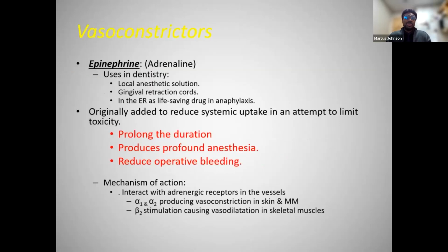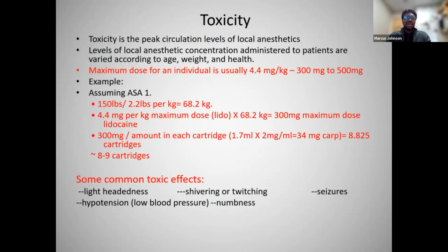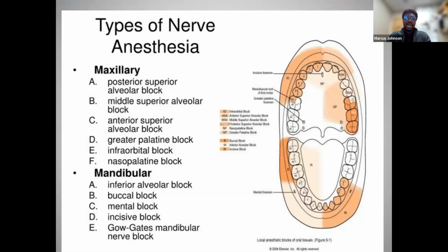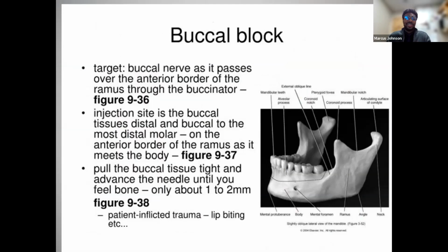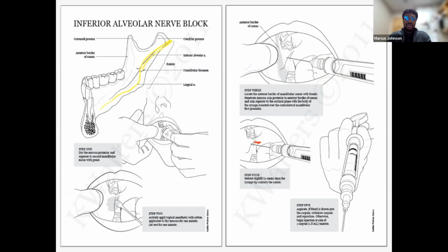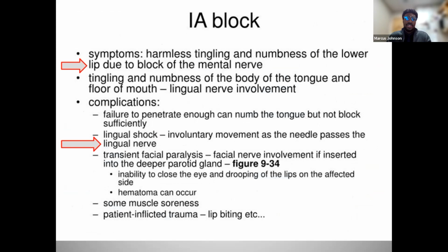So this is just something I was going to speak on, but based on time, I'm going to kind of breeze through the anesthetic techniques. I really just wanted to highlight something that has significantly transformed my practice, which is the intraosseous technique.